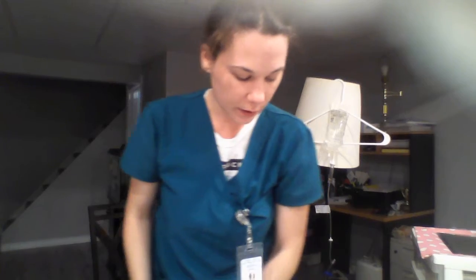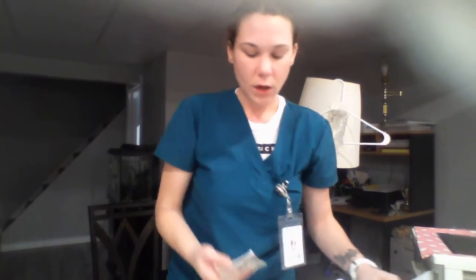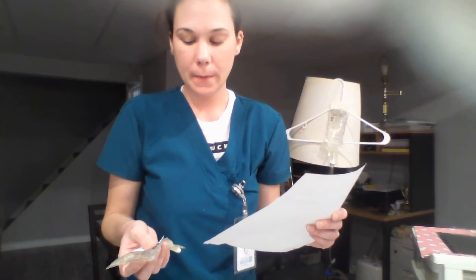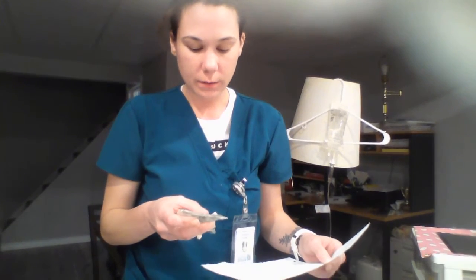Okay, I'm going to go right into my third check. So it's for Sid Garland. The medication is ceftriaxone, 500 milligrams, and we will be regulating our drops per minute to 25 drops per minute. So yeah, 500 milligrams.